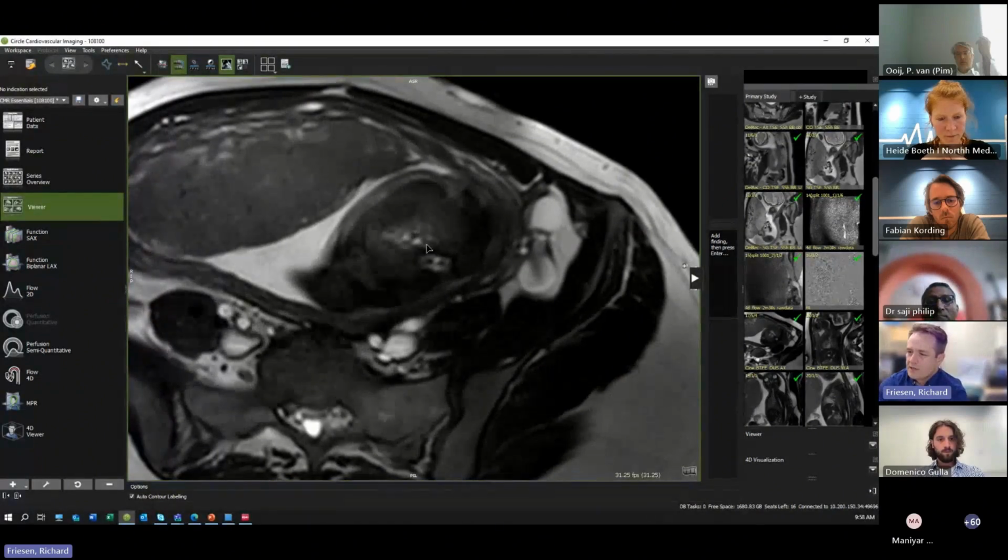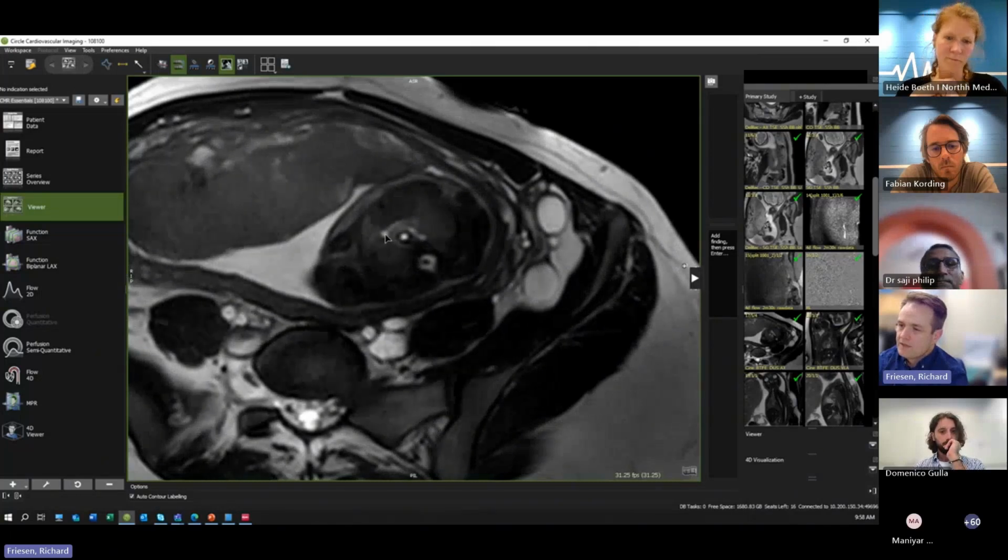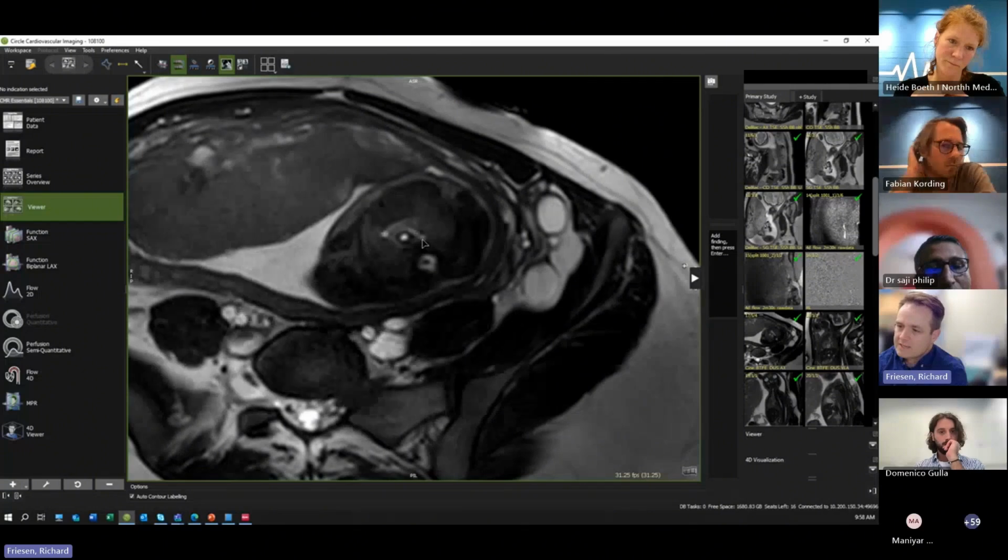So we're starting superiorly. We see pulsatile flow likely that we expect from head and neck vessels. This is the innominate artery, and we see a little signal coming out here towards the right subclavian. This is a more anterior venous structure that we'll see will turn into the right-sided superior vena cava. We see our innominate vein coming over here. Two more head and neck vessels, the left carotid and left subclavian, and our airway here.